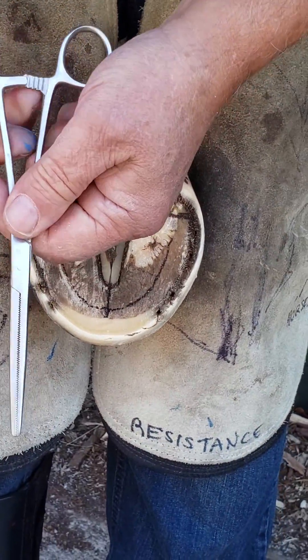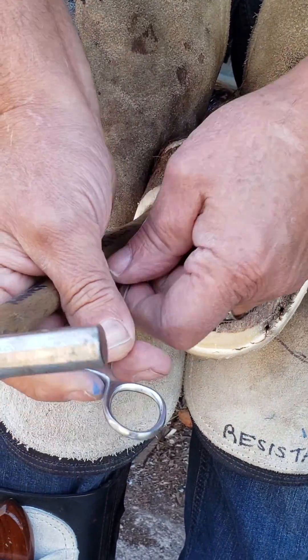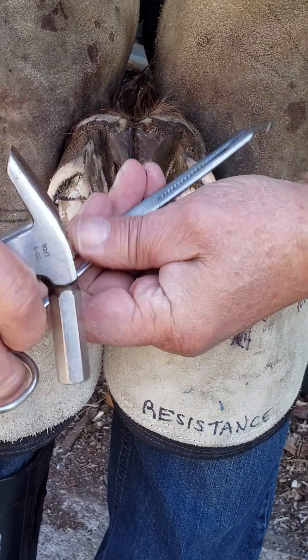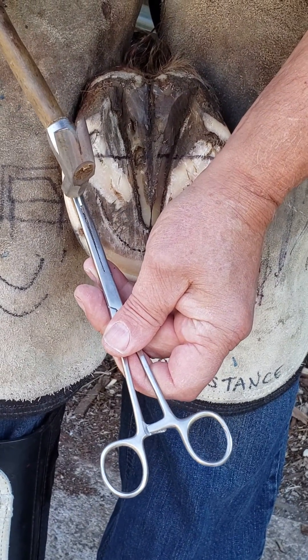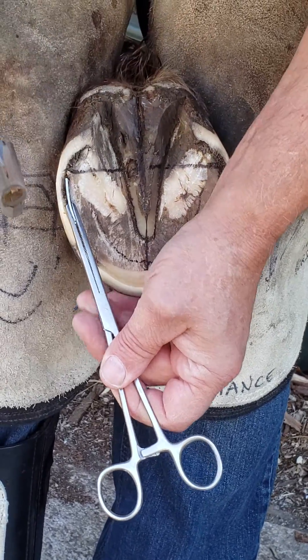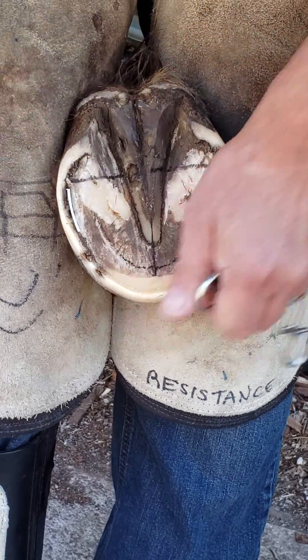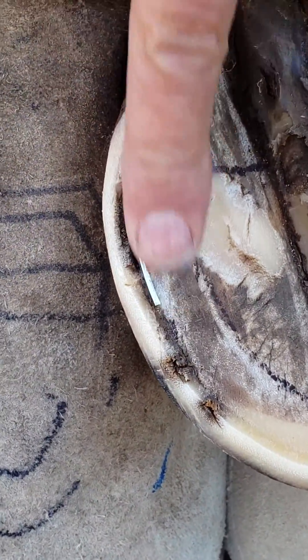What I found is if I use this tool — the forceps — to hold my tap, I don't end up banging my fingers and it makes it much easier. I can position it, and we want to go straight in, not at an angle. So I go straight in, get it started, get it flush, and I'm done. Nice and even.